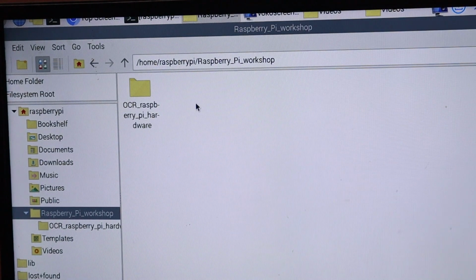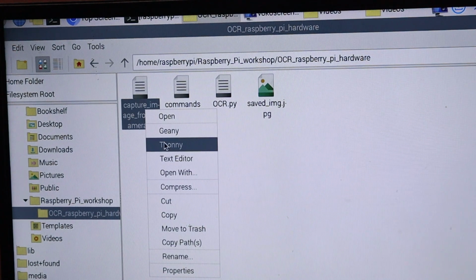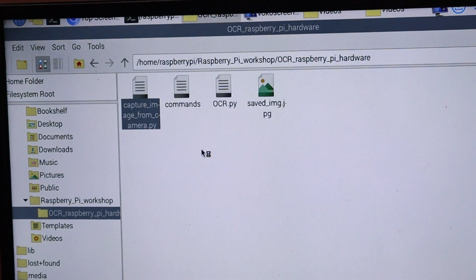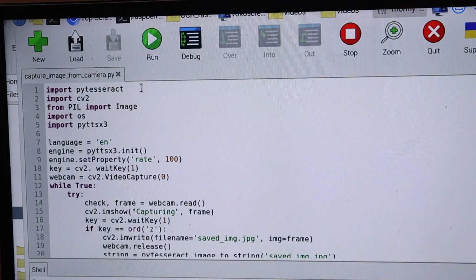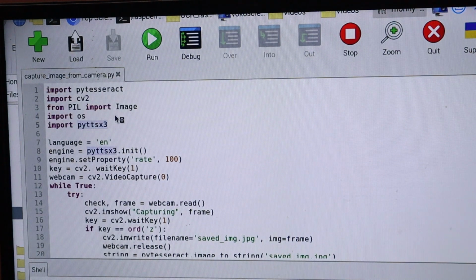Once you get this folder, go inside it, right click on this folder and open with Thonny. Whatever I am doing right now is on the Raspberry Pi screen, not on my laptop. Whatever you have to do, do it on the Raspberry Pi screen only. Once you open with Thonny, you have to click on this run button. Before that, you have to install all these libraries. How to install them, I will tell you after this practical demonstration. If you want to run this project, just click on this run button.